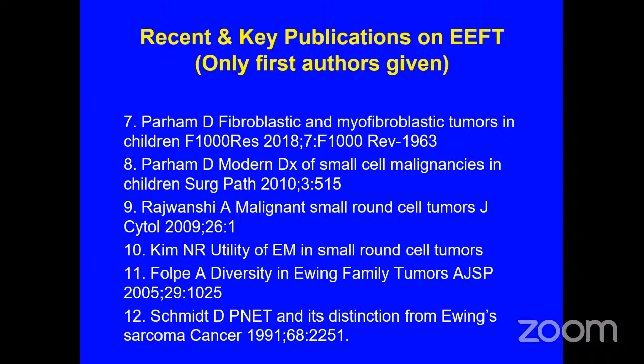Thank you, Dr. Joshi. Here is one more question. Is BCOR positive in both BCOR-CCNB3 and BCOR-ITD? Well, BCOR is positive in both, yes. But CCNB3 will be negative most likely in BCOR-ITD, because there is no fusion partner there in these tumors. In BCOR-CCNB3 fusion sarcomas, you will get CCNB3. In both these tumors, BCOR fusion sarcomas and BCOR-ITD, you will get positive staining for BCOR.